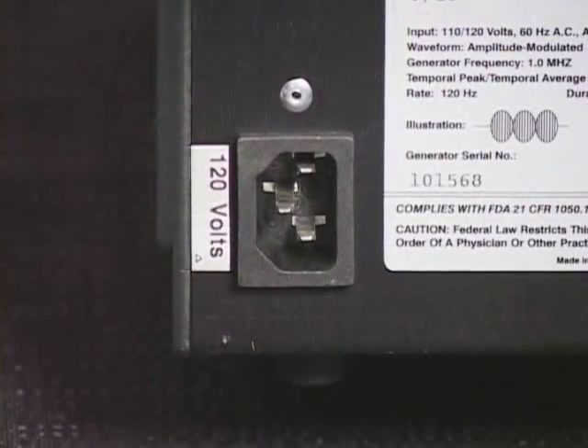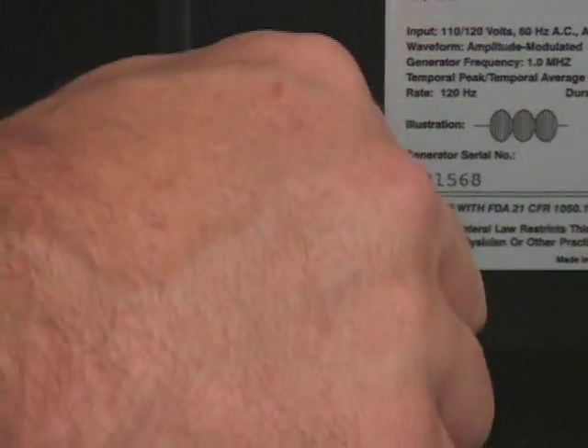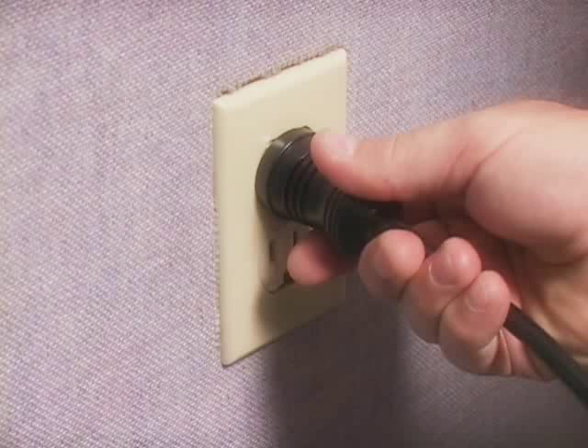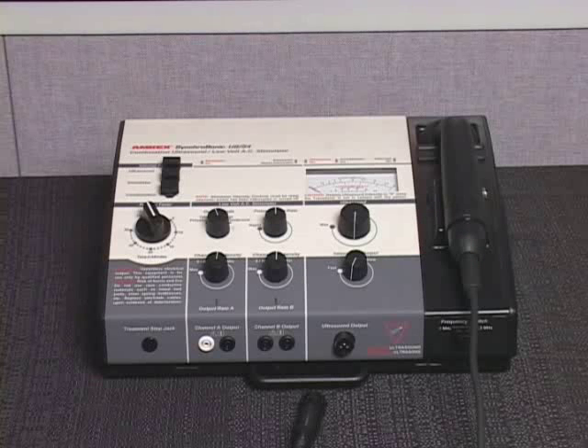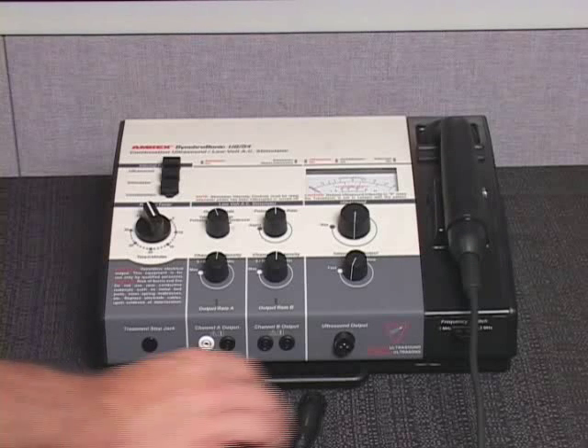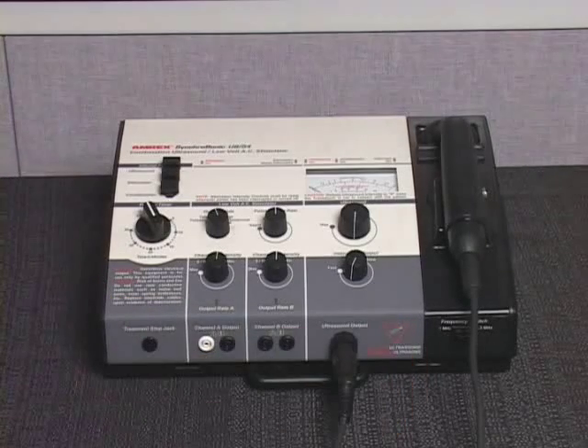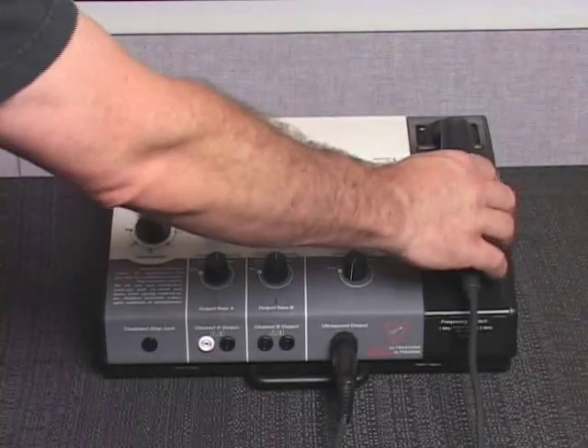In order to operate the ultrasound modality of model US54, you must first connect the power cord to the AC receptacle on the back of the unit, and insert the power cord plug into a properly grounded AC receptacle. Connect the assigned ultrasound transducer to the generator's ultrasound output transducer connector and place the handle in the transducer cradle.